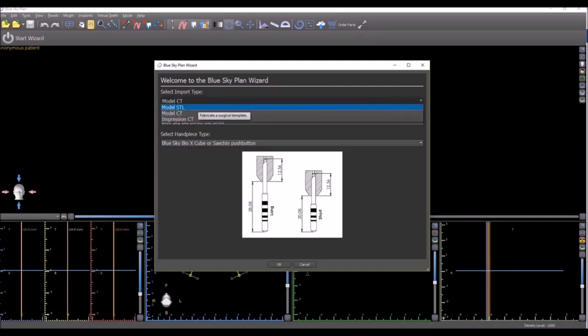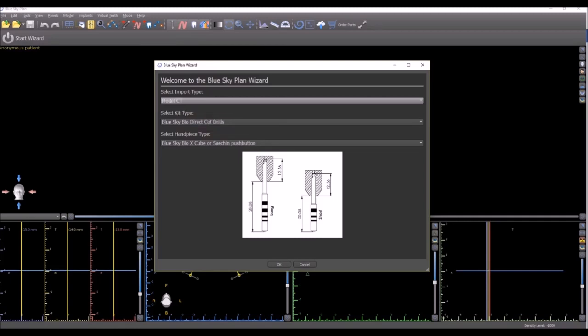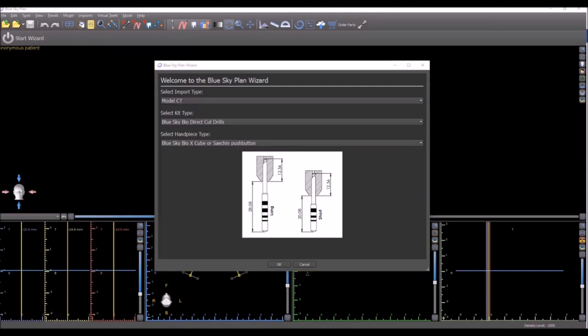Whether it's a model STL, model CT, impression CT, and of course, depending on the selection of the user, the wizard will take the user through a different process flow.